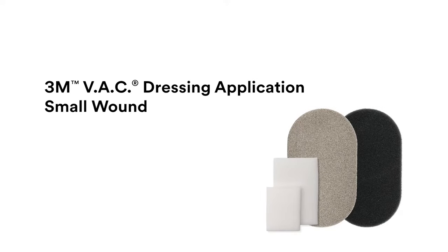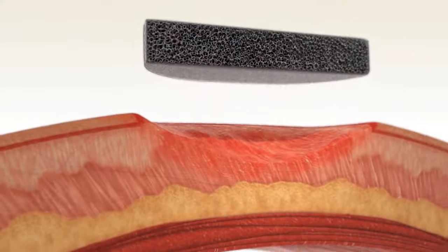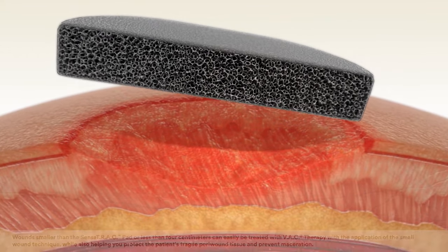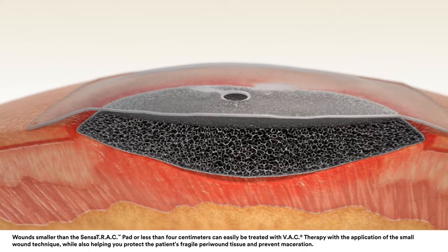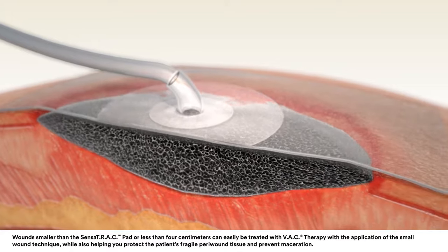The 3M VAC Therapy System is an integrated wound management system for use in acute, extended, and home care settings. When used on open wounds, it is intended to create an environment that promotes wound healing by secondary or tertiary intention by preparing the wound bed for closure, reducing edema, promoting granulation tissue formation and perfusion, and removing exudate and infectious material.